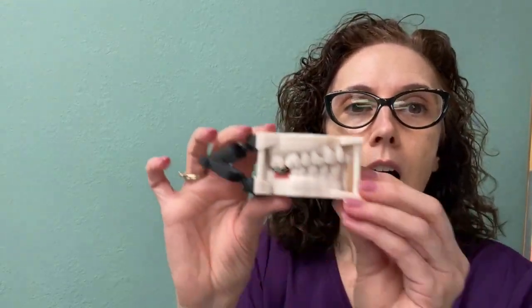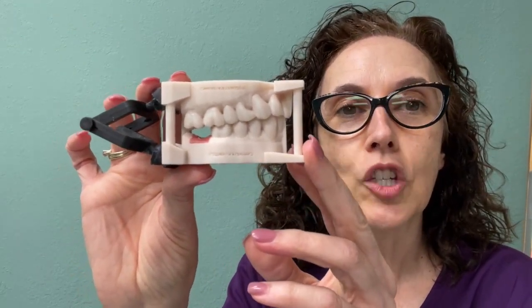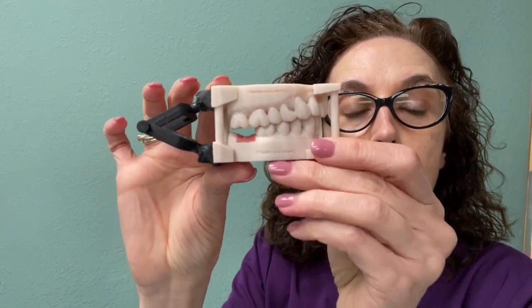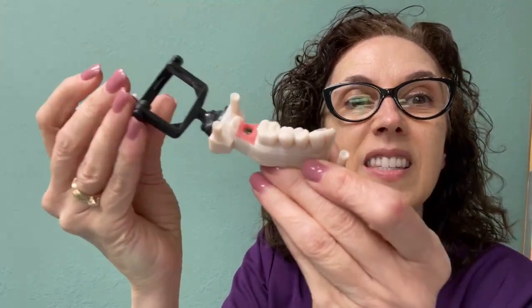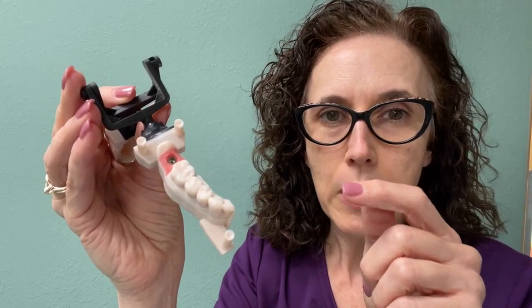So this is an example of a scan that was completed. This patient is missing this very last tooth, and this is the digital model that was printed out. And so you can see here again is that implant. This is actually an analogous sample of what an implant would be like, but it's basically the same thing. The implant that goes down into the bone that you really can't see. And there's so many different brands and types and styles and everything, but they're generally speaking all the same. So the implant is down in the bone.